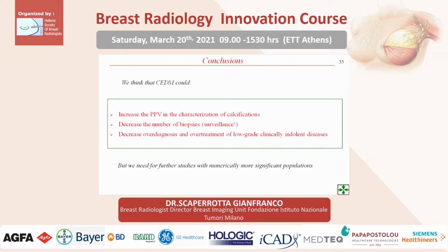It's necessary to study in the world, but I think the use of CEM before the VAB or the biopsy in general is very important.